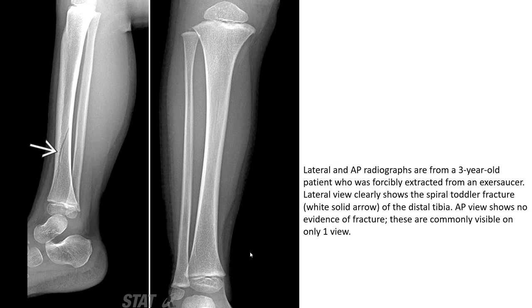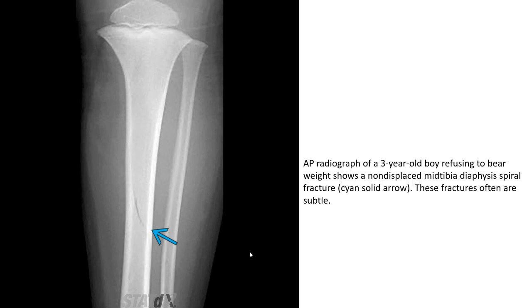The AP view shows no evidence of fracture — these fractures are commonly visible on only one view. AP radiograph of a 3-year-old boy shows a non-displaced mid-tibial shaft spiral fracture, indicated by the cyan solid arrow. These fractures are often subtle.